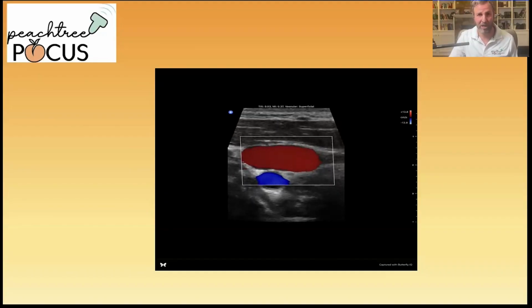While you can simply look at the artery and see if it's pulsatile, another method of performing a POCUS pulse check is to compress the artery until the accompanying vein, either the femoral or carotid in this case, rather IJ, would disappear. Compression will bring out the pulsatility and make it easier to see that pulsatility.